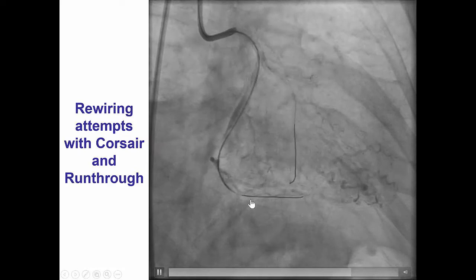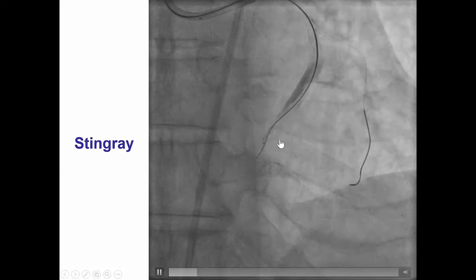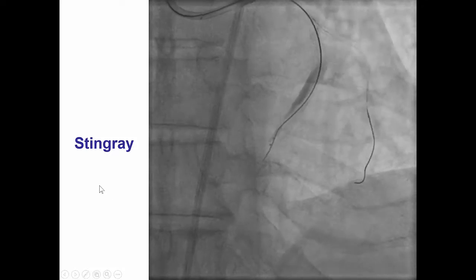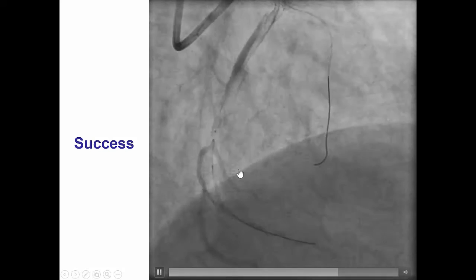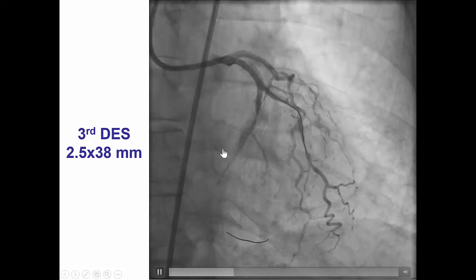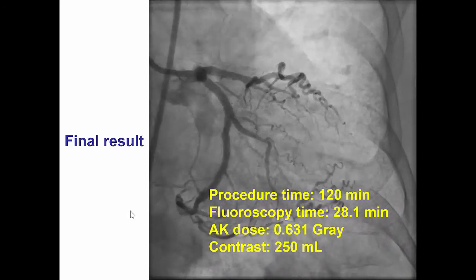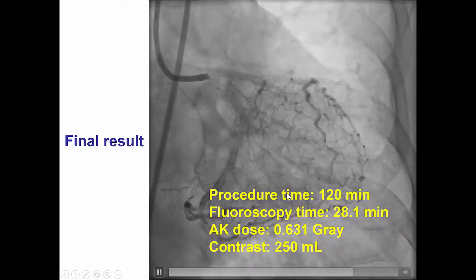Brief attempts to rewire with the microcatheter and wire were unsuccessful, and then we decided to attempt re-entry using a Stingray system, immediately proximal to the bifurcation between the left posterior descending artery and the left posterolateral branch. We were actually able to do that immediately proximal to that distal trifurcation using the Stingray system. We pre-dilated, then placed a long 2.5 by 38 millimeter drug-eluting stent, performed final kissing balloon inflation, and achieved an excellent result with excellent TIMI flow in all branches of both the distal circumflex and the first obtuse marginal branch.